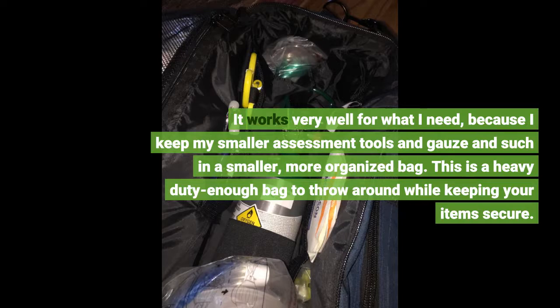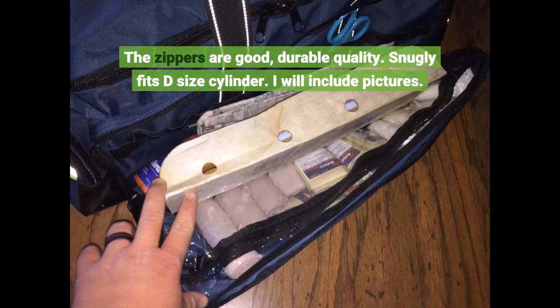This is a heavy-duty enough bag to throw around while keeping your items secure. The zippers are good, durable quality. Snugly fits a D-size cylinder.